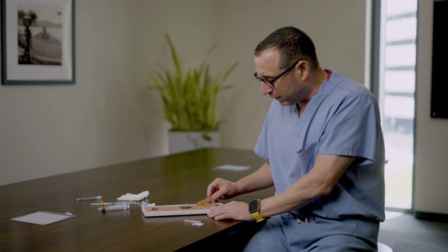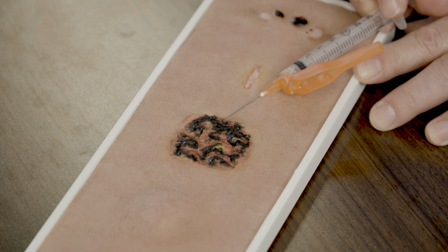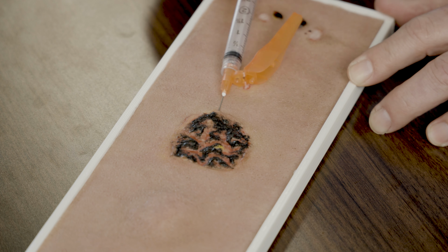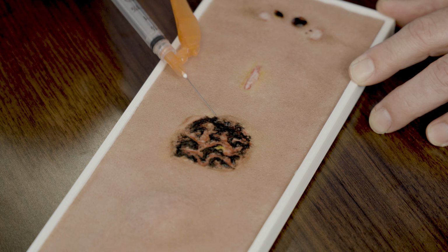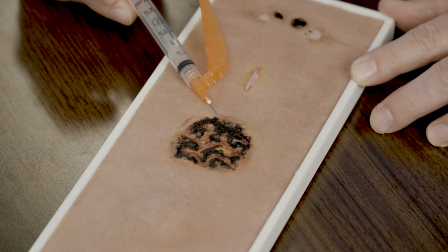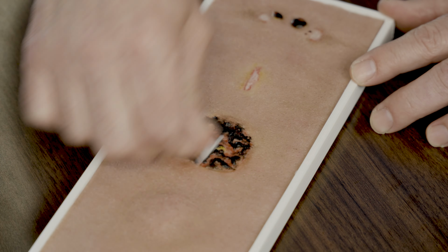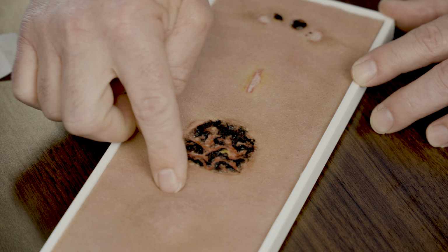So I'm going to go a little deeper, and using a fanning technique, I'm going to distribute the amount of injectate through the entire lesion. And as you can see here, I can inject this entire lesion through a fanning technique without withdrawing the needle. And then again, we gently aspirate. We wipe down afterwards the entire lesion with an alcohol wipe. We place Mastisol around it, and then a Tegaderm that goes on top of that, and that stays there for 7 days.